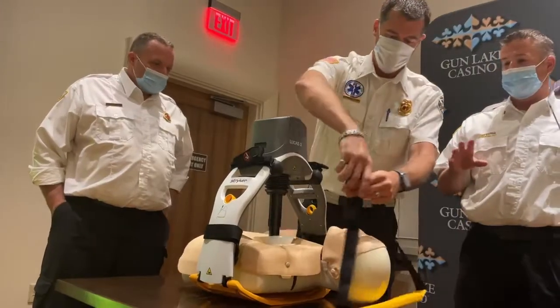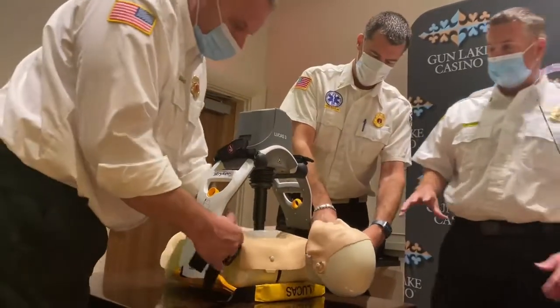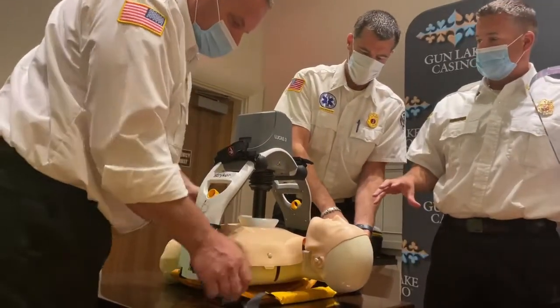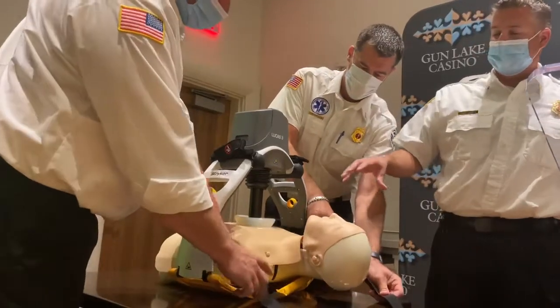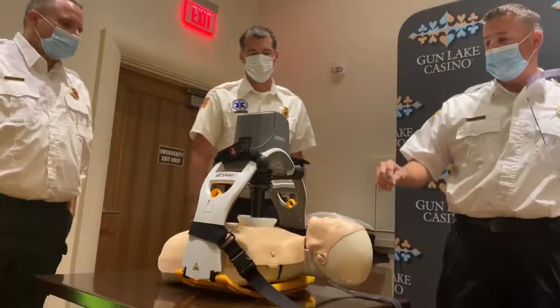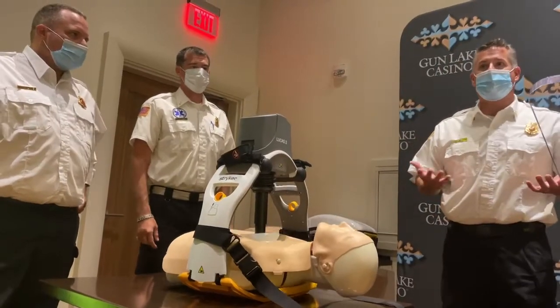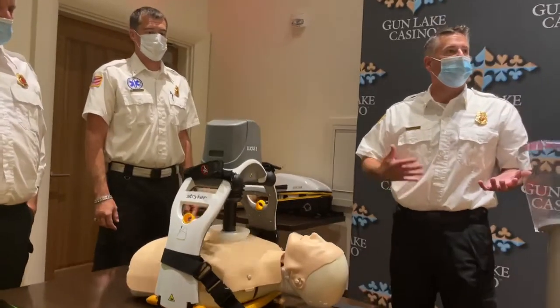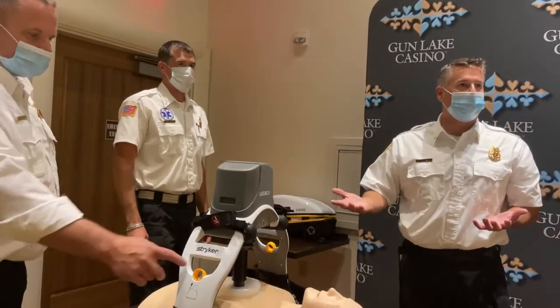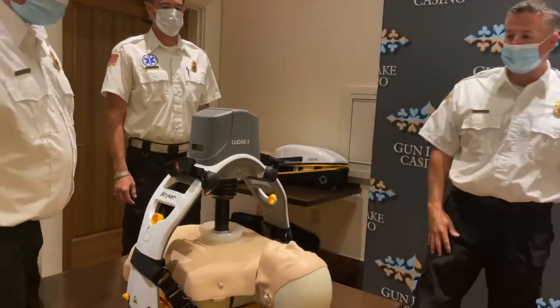So everything is perfect. At this point, that frees up another person. It starts, does 30 compressions, then 2 breaths — it stops, gives you a warning, and you can do your breaths. So you can see with the extended response from EMS for 15 or 20 minutes, we would wear out a person after a few minutes, whereas this takes the place of that person.